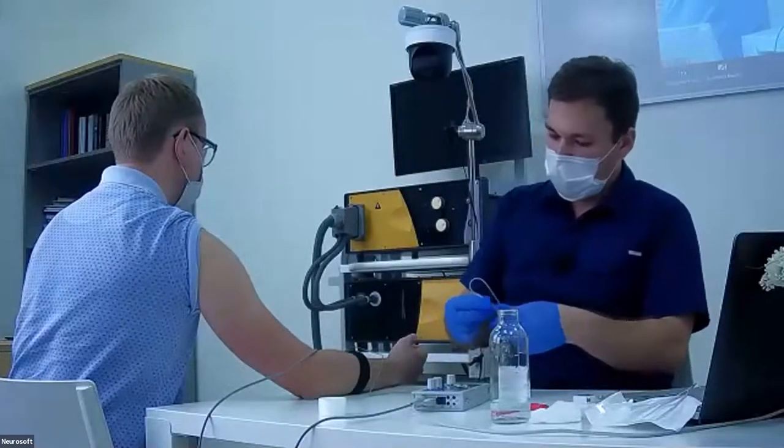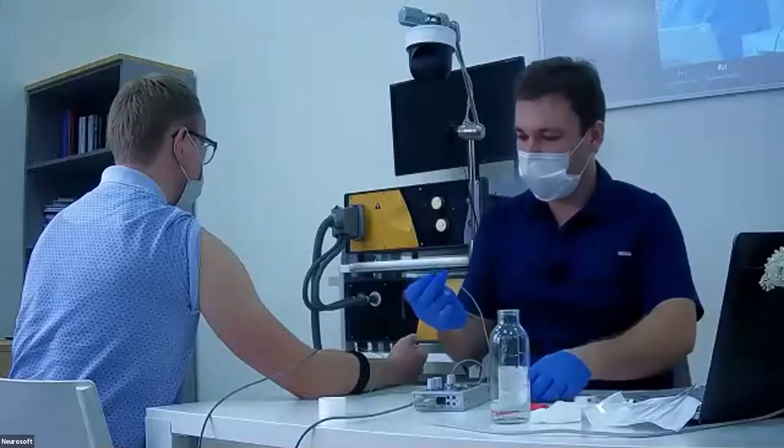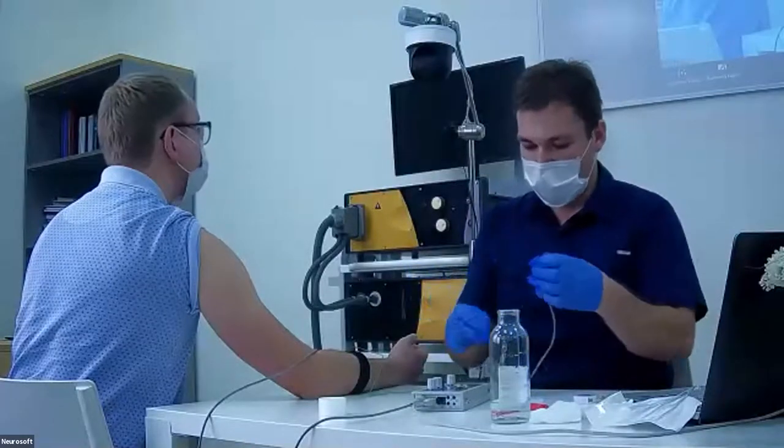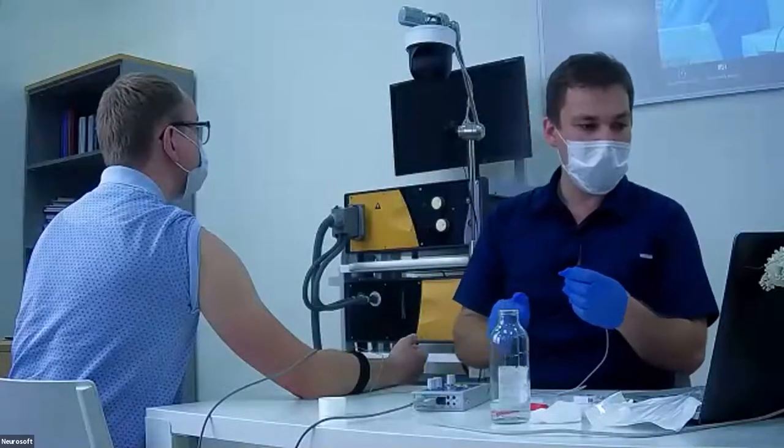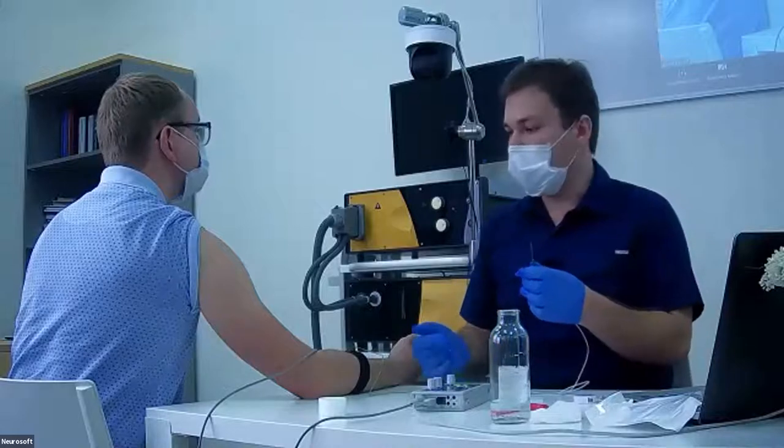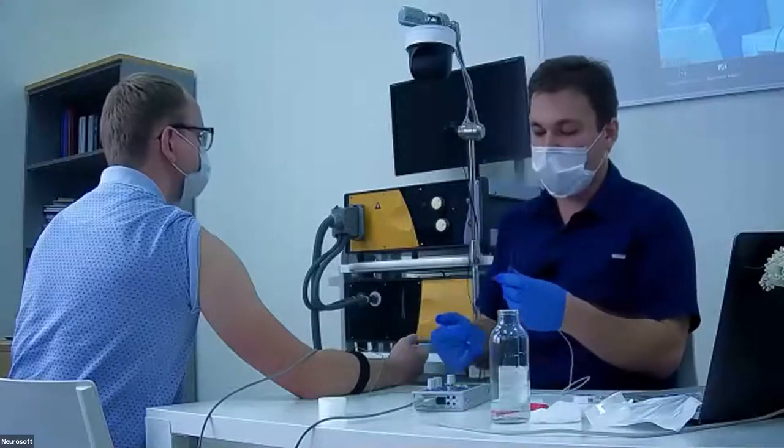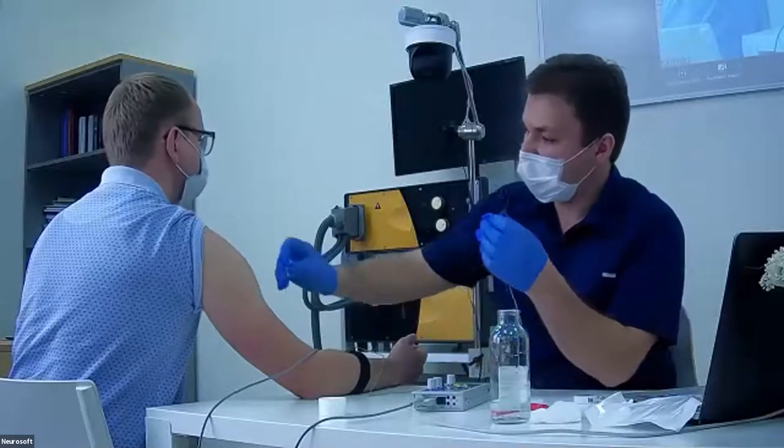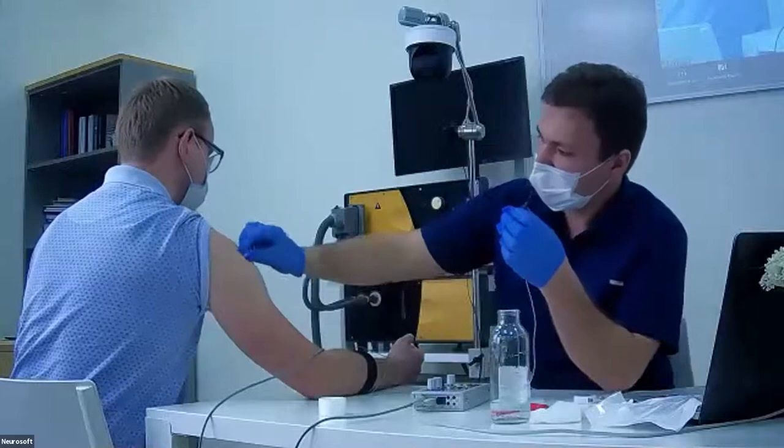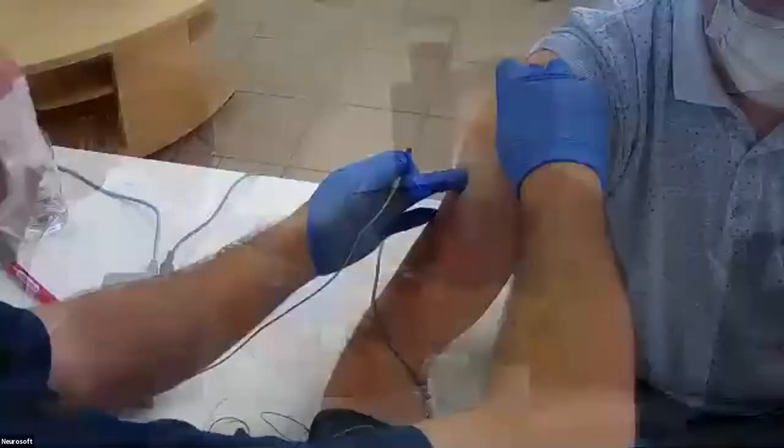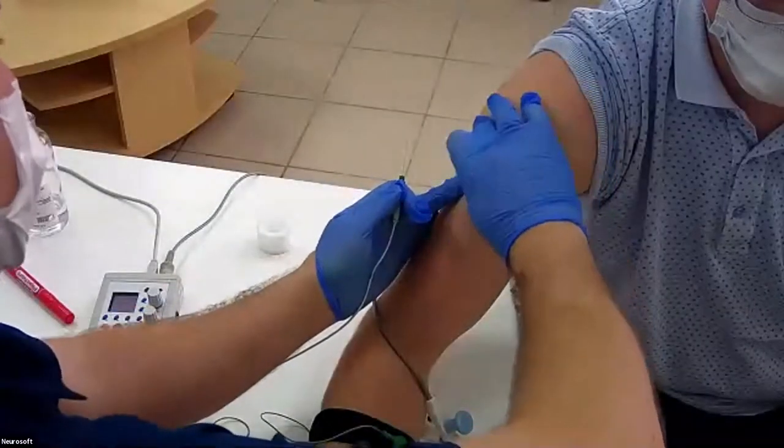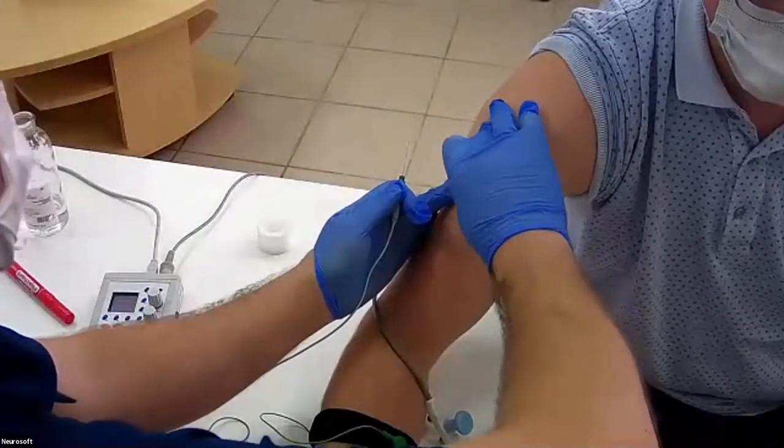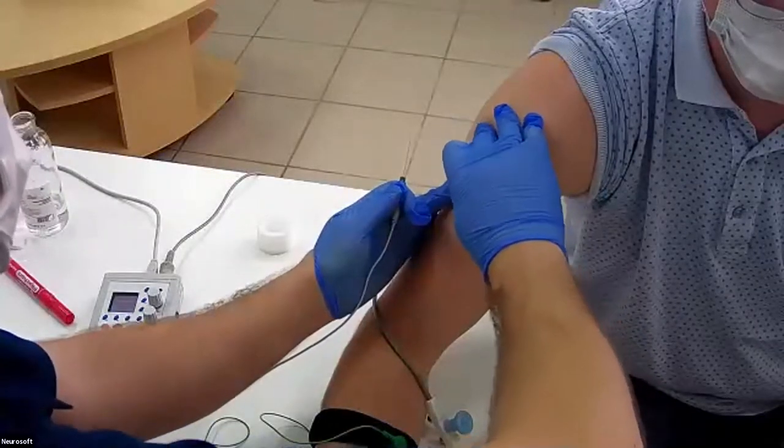We will use this 37 millimeter needle for the deltoid muscle. We will examine the middle part of the deltoid muscle.